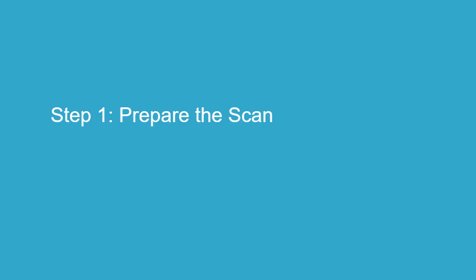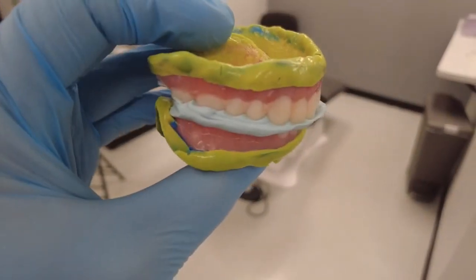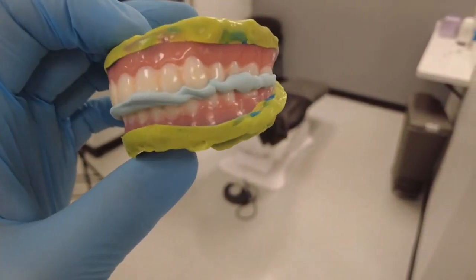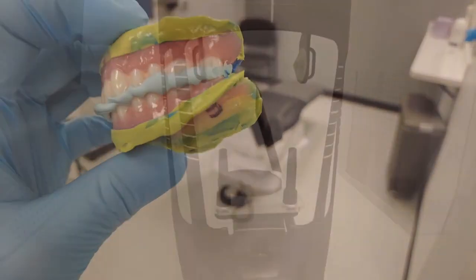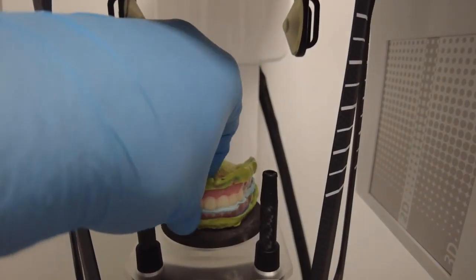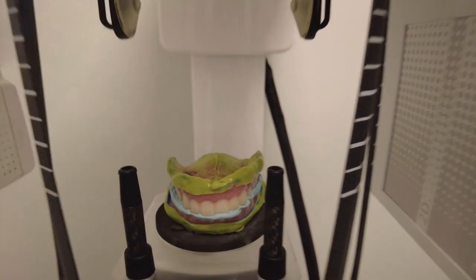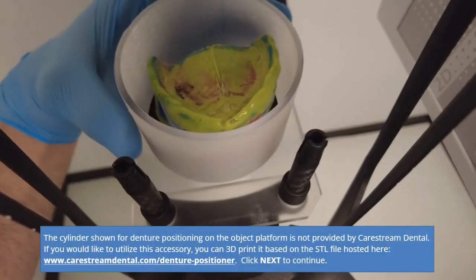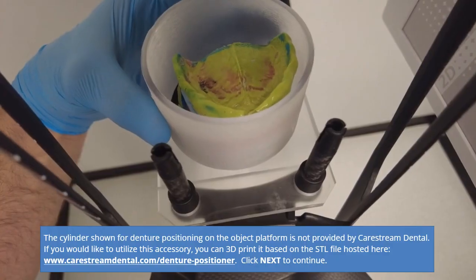Step 1: Prepare the Scan. To begin, ensure the denture is ready for scanning. Trim any excess impression or bite material. Place the denture, model, or wax rims on the scanning pad. The position is the same regardless of the scanning equipment you are using. Use the 3D printed cylinder for centering. If necessary, flip the mandibular denture upside down for balance.